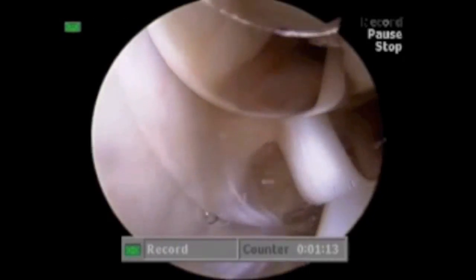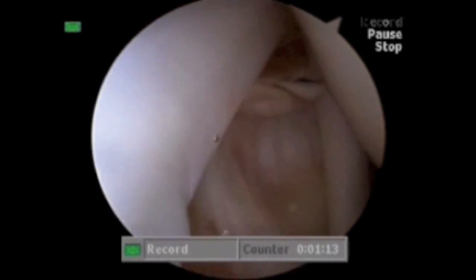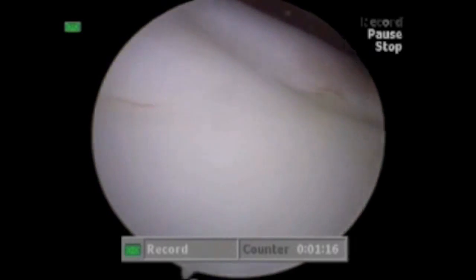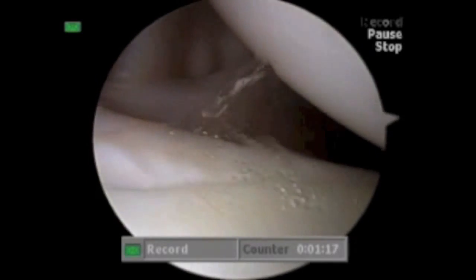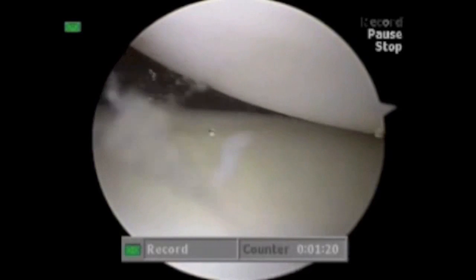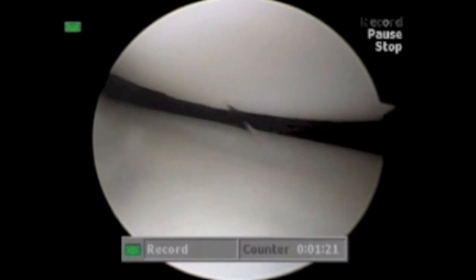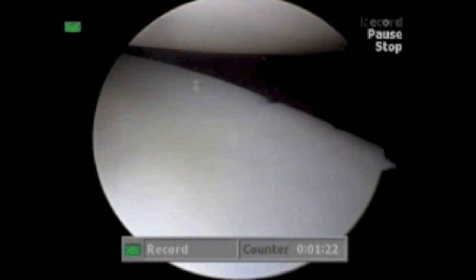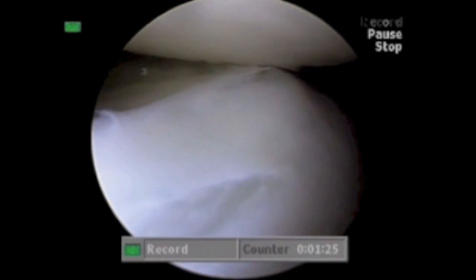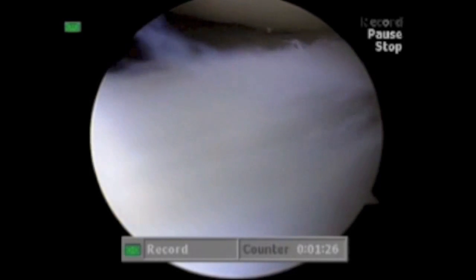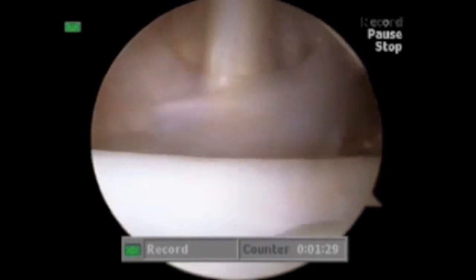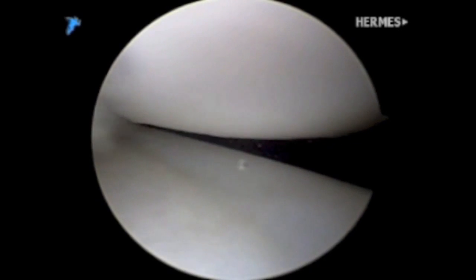Intraarticular pathology usually consists of a patulous rotator interval, a normal labrum, and articulating surfaces, as MDI is a capsular pathology. Chronically, there can be some labral damage, as you can see posteriorly in this case. The drive-through sign is also markedly positive.